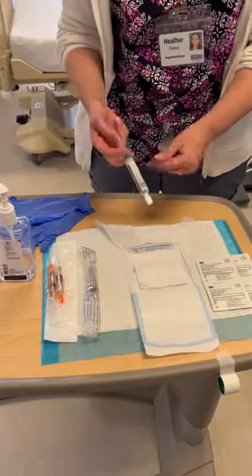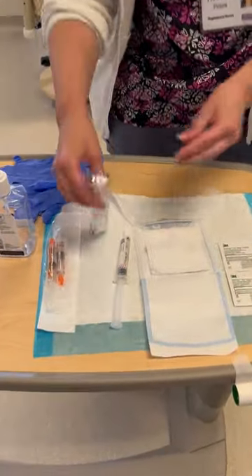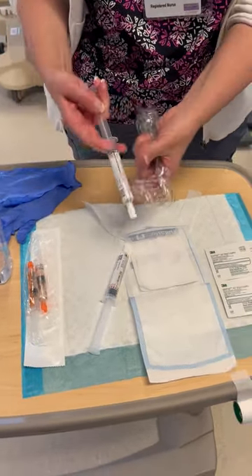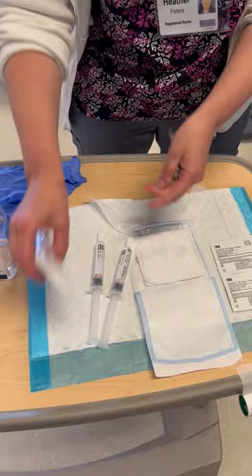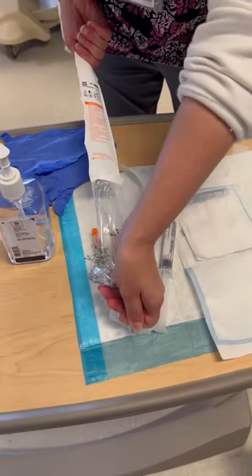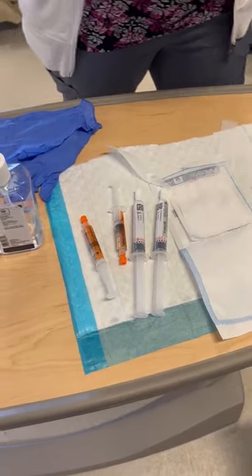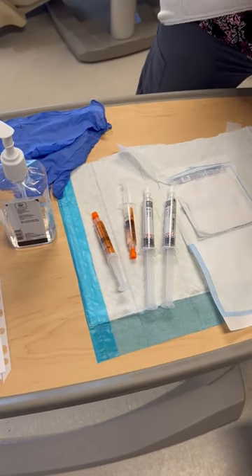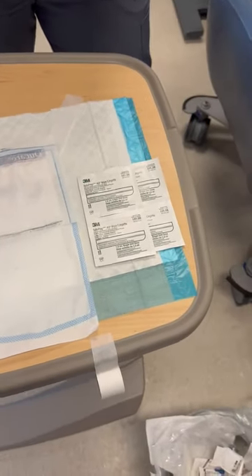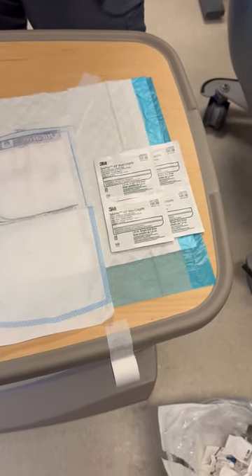This connection is on the 5008S machine. We have sanitized our hands and we're going to open our supplies onto a clean blue pad. We have two pre-filled 10 milliliter saline syringes, a package of sodium citrate that contains two syringes, our sterile 4x4 gauze, and four chlorhexidine gluconate swabs.